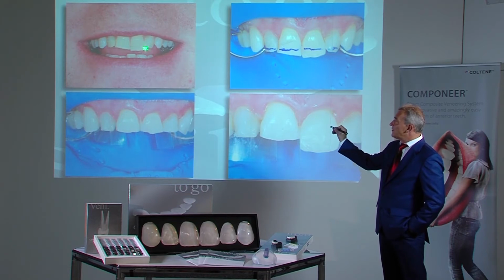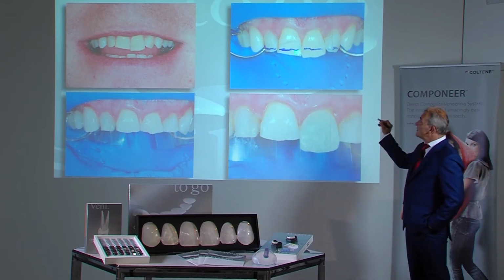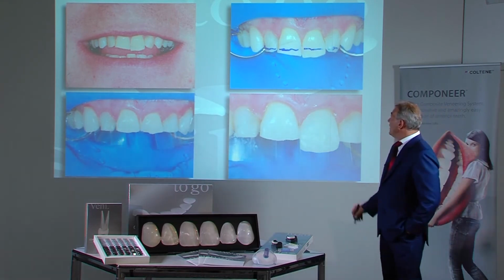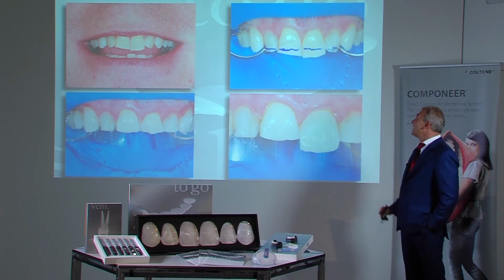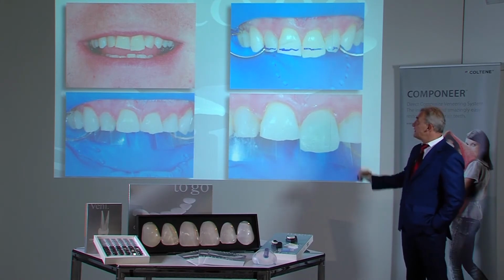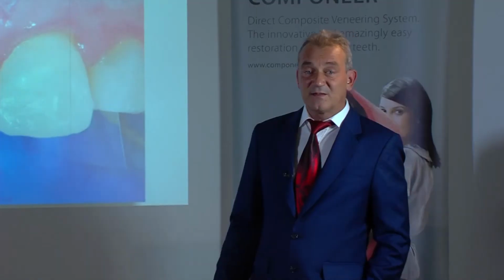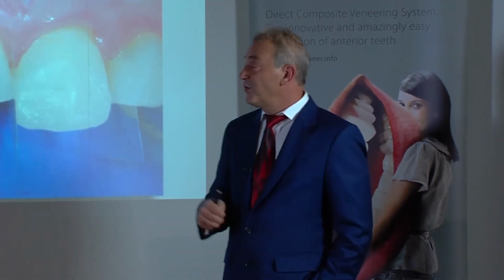Using a pencil, we mark where the lower anterior teeth pass over the upper ones. Using a permanent marker, we draw a line to designate by how much the teeth need to be shortened. As the tooth more or less has its complete length, one can assume that dentine will be found after 1.2 or 2 millimeters of enamel. There is therefore no risk for the pulp.